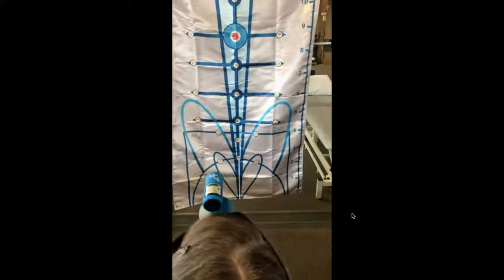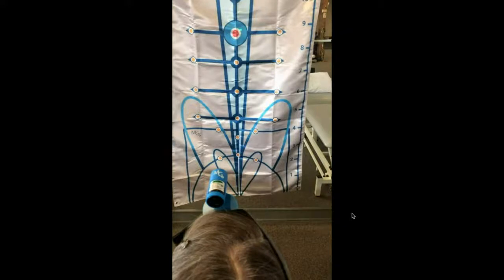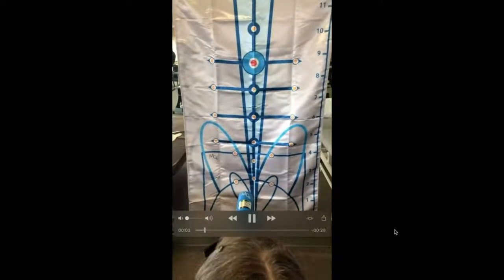All right. And so you can see how she really wants to now go to the right with her dominance, but that affected her coming back to the left, and that made her a little dizzy. Okay, so let's watch that again. They're only about 20 seconds long.